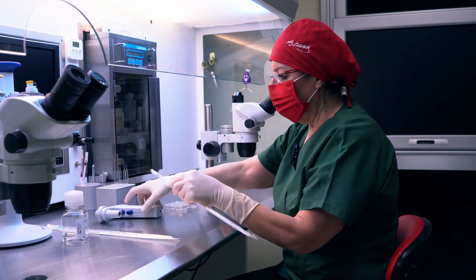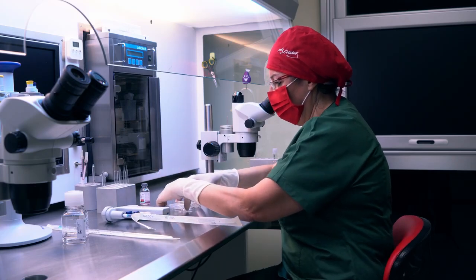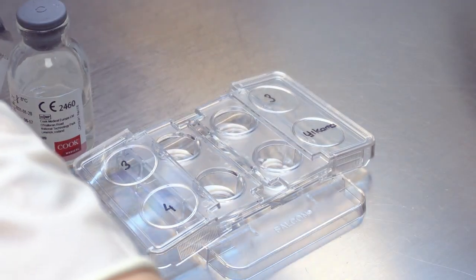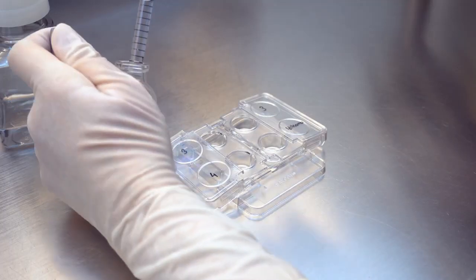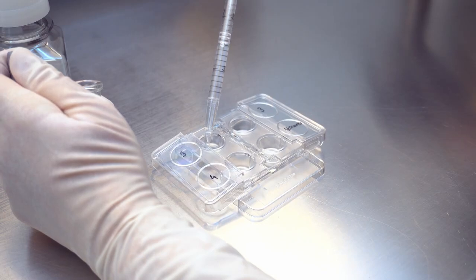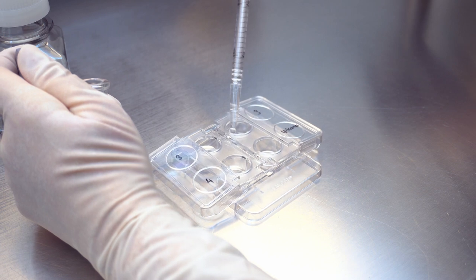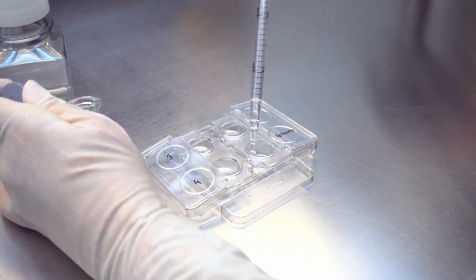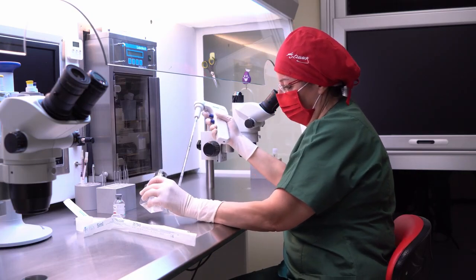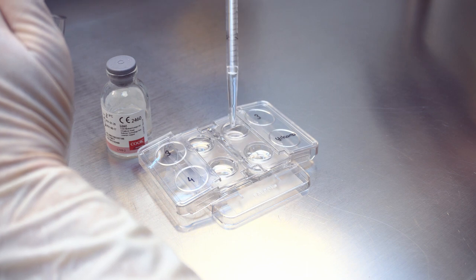A sufficient number of 4-well culture dishes are prepared the day before oocyte retrieval. Each well is filled with 0.5 milliliters of fertilization medium. Afterwards, each well is covered with a layer of 0.3 to 0.4 milliliters of mineral oil.